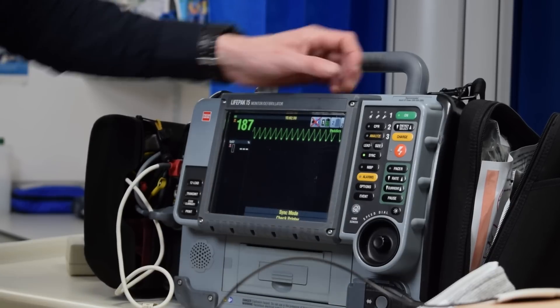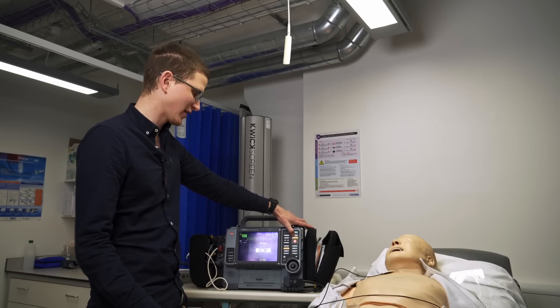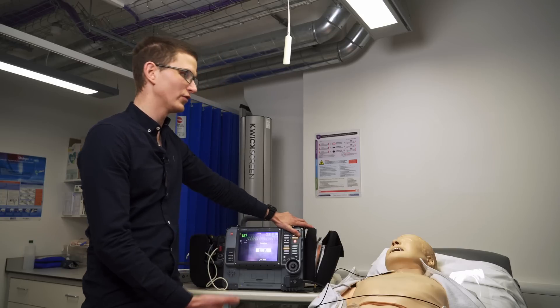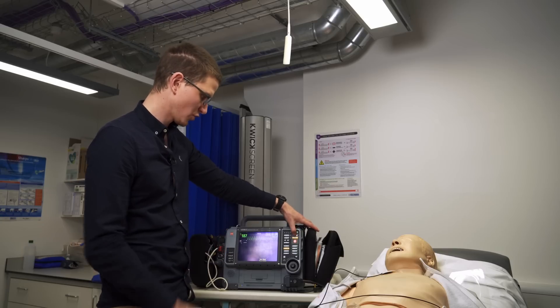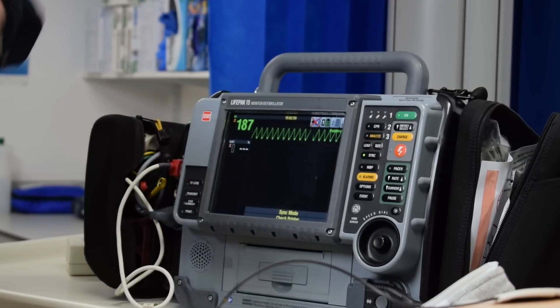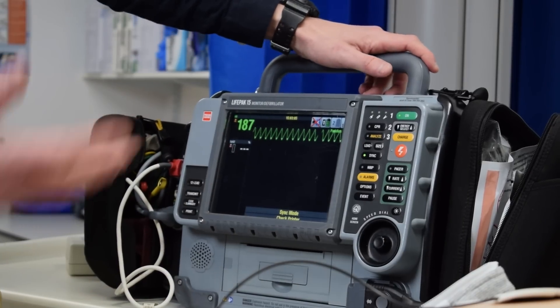We need to charge but we need to select our energy joules. Typically most protocols are going to have you start at about 100 joules for ventricular rhythms. For atrial rhythms it's actually a higher dose, but that's another story. So we've selected our dose, we've hit sync, you can see it's flashing here and we have little dots next to the screen. Pads are on, we're going to charge.